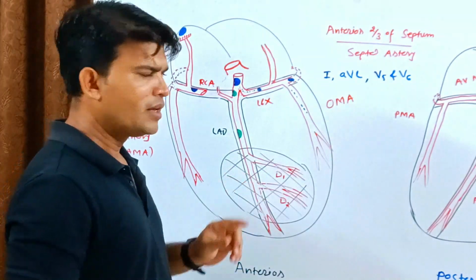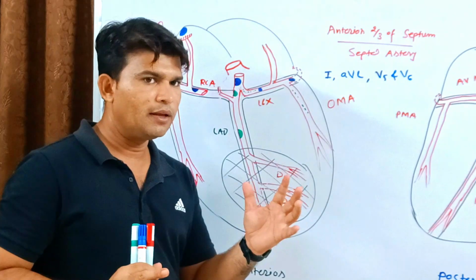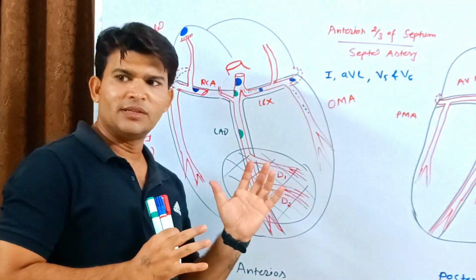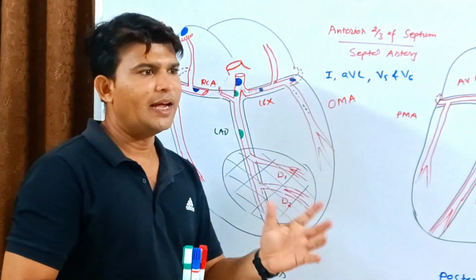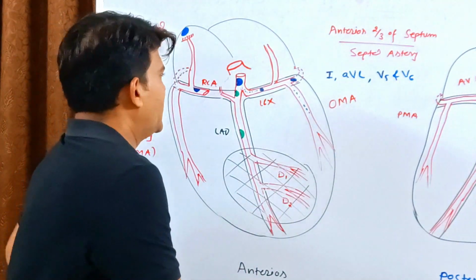Is it clear? So let's discuss the involved artery, and the ECG leads and its territory, right? Okay, let me discuss randomly.